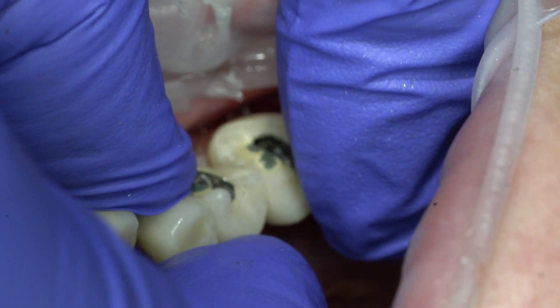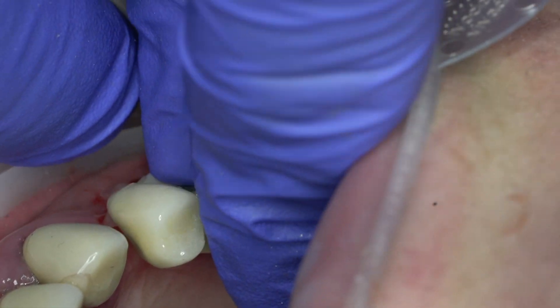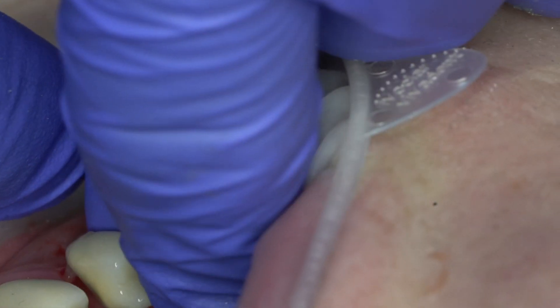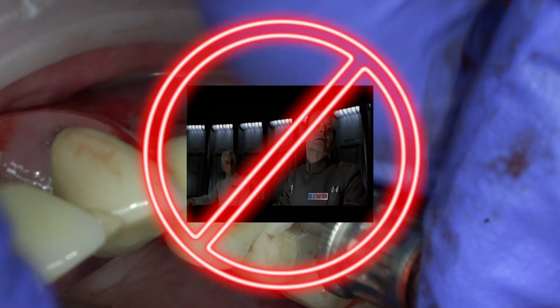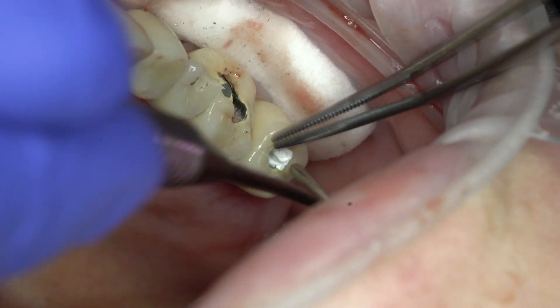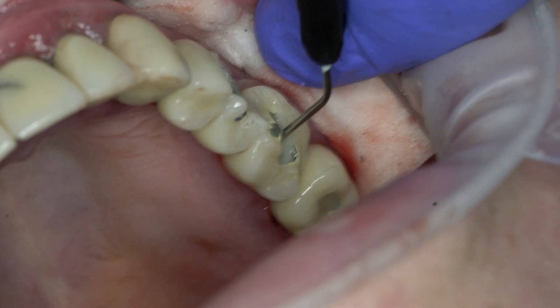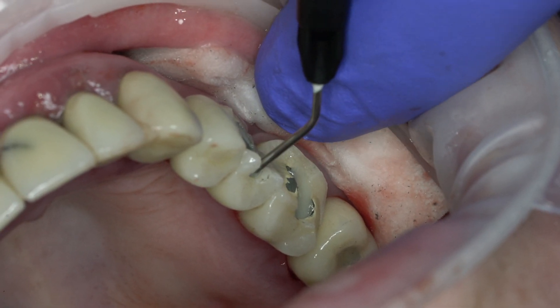Be careful when positioning the crown back, since due to the divergence of the implant axes, it is not always possible to immediately find the axis of introduction. Force is unacceptable. After tightening the screws and closing the shafts with fluoroplastic sealing material, it remains to close the hole, restoring the shape of the crown with composite, even with severe damage.